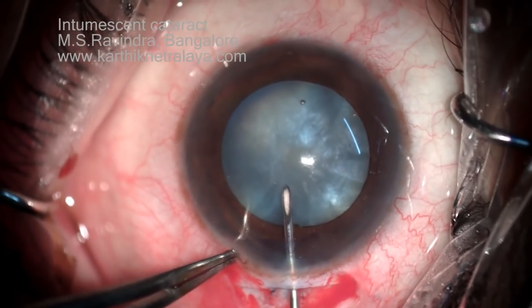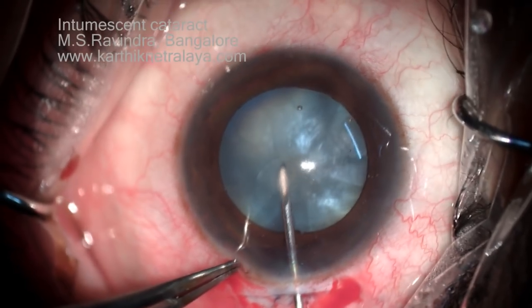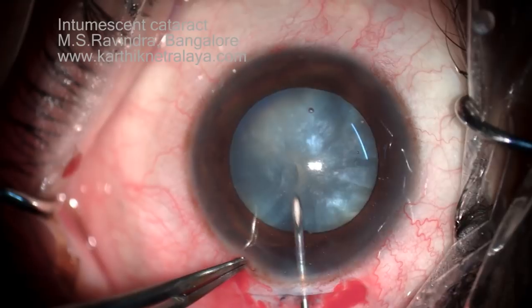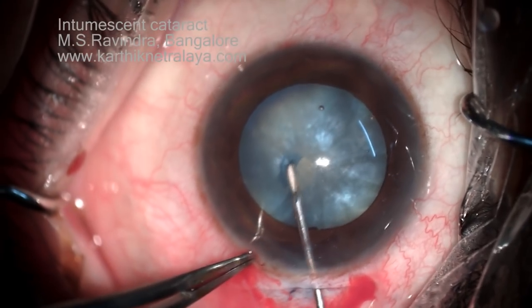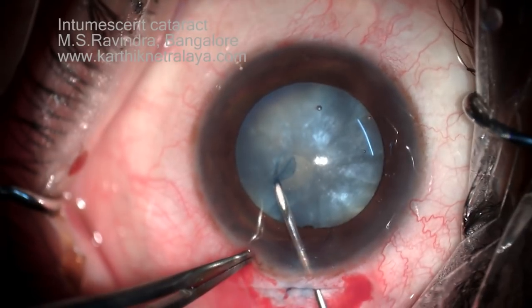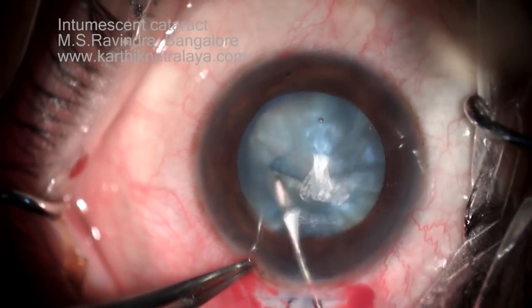Tunnel floor entry technique: I am entering the anterior chamber not through the main entry into the tunnel, but at the limbus — I perforate the floor of the tunnel and enter the chamber. In this way the viscoelastic remains in the anterior chamber tightly packed so that the anterior chamber does not shallow.